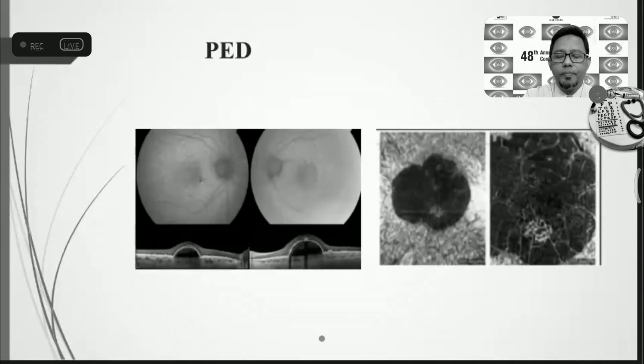In case of PED, OCT shows the optically empty space present beneath the retinal pigment epithelium, but OCT angiography reveals the image of the neovascularization that may be seen on the scan passing beneath the retinal pigment epithelium. The neovasculature is clearly visible on the dark background, as seen by the distance between the layers of the retinal pigment epithelium and the choroidal plate.